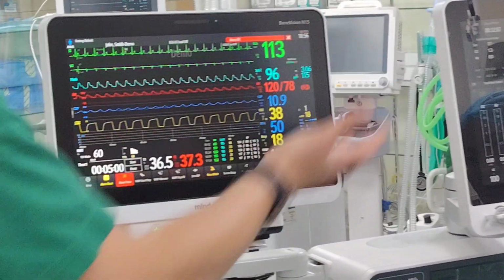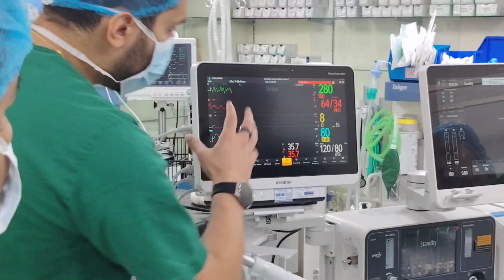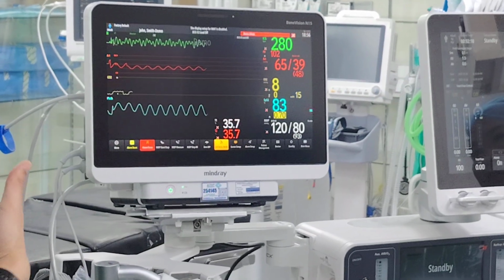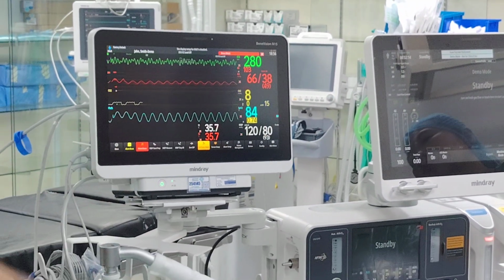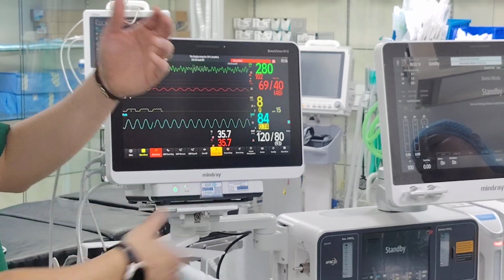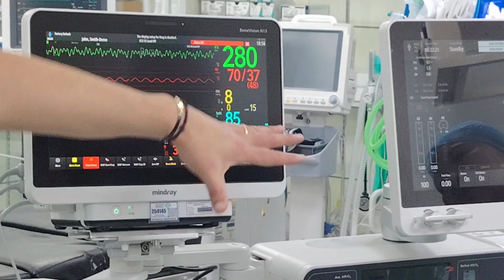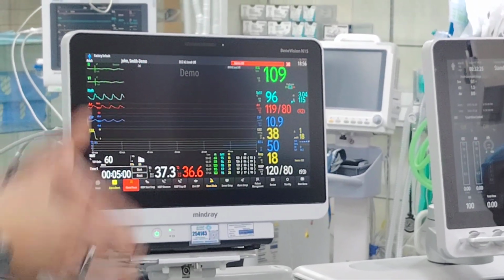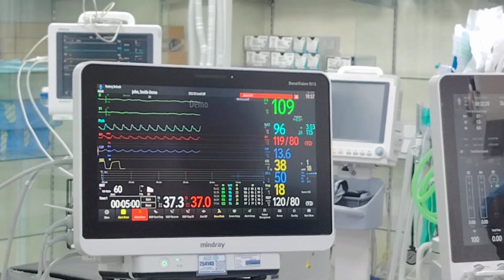It will enter a resuscitation mode, meaning all the alarms will be turned off. Only the important information, you see? No need for NIBP because the heart is arrested, it's useless. No need for BIS, right? Only the important things will appear in front of you. Patient, inshallah, he goes back to ROSC. You press exit, goes back to normal. And this is a nice thing. So you want to permanently silence during the resuscitation mode, just to communicate properly, you can click on this.